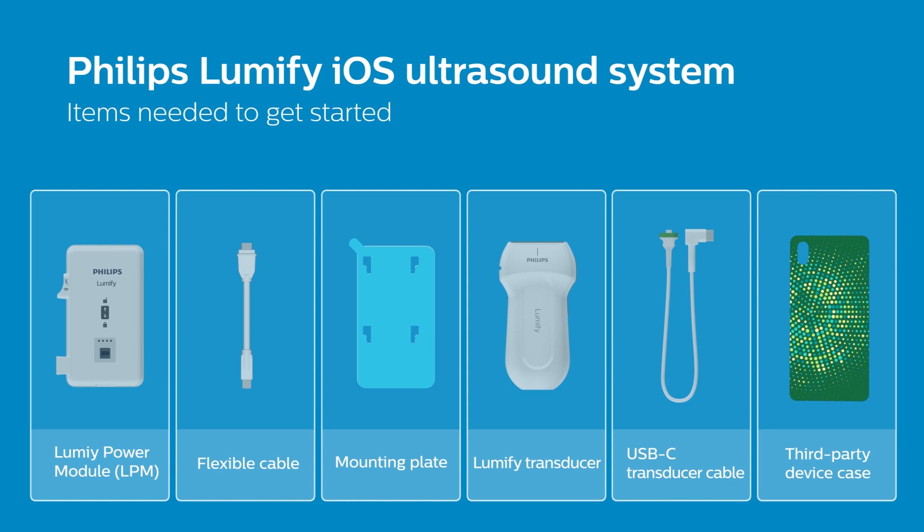Please refer to our website for a full list of compatible iOS devices. If you have ordered a device case with LPM mounts, check out our video on how to set up your Lumify iOS system with the Philips provided device case. It is recommended to use a case with a flat back surface made of hard plastic to allow the mounting plate adhesive to correctly attach to the case. For more information, please refer to the documentation included with your purchase.